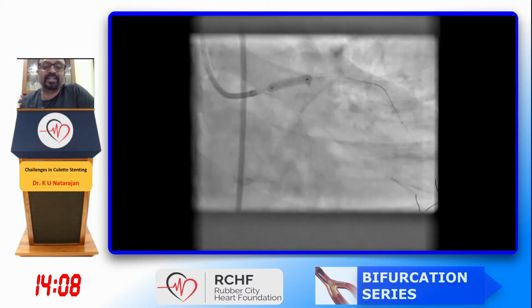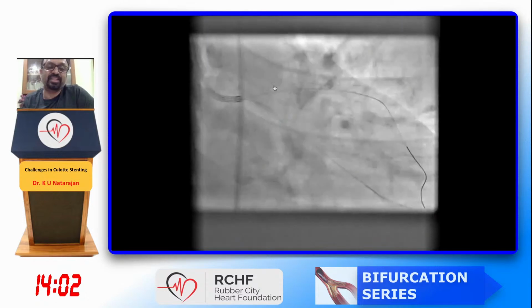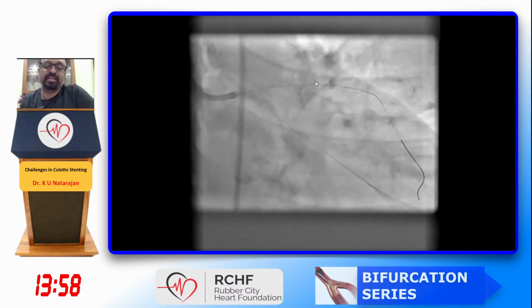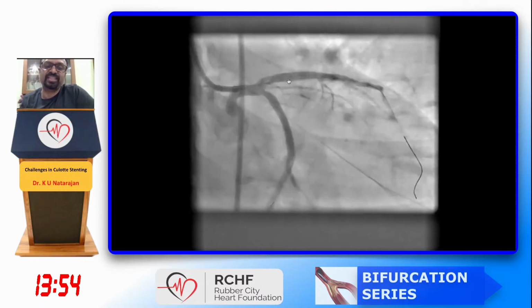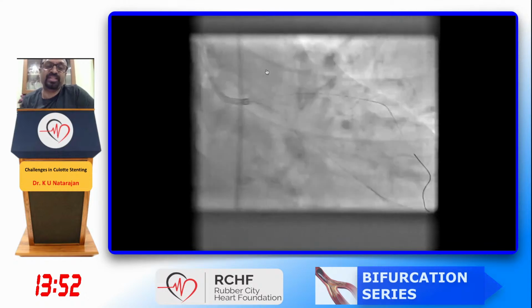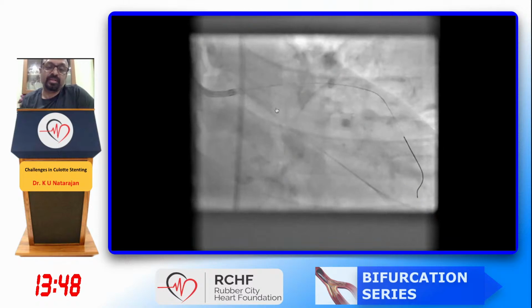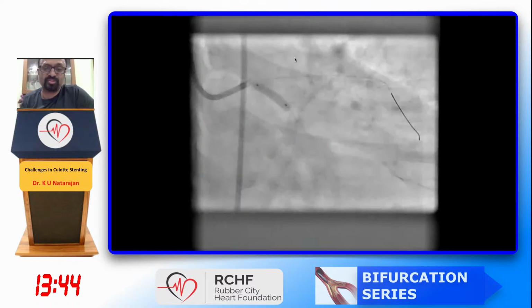So both the LAD and the circumflex were wired. The LAD was dilated with a 3 millimeter balloon, and you can see that there is an ugly dissection at the ostium of the LAD here. This patient became a little symptomatic, the way Dr. Tom was telling in his third case. Though the flow was good, the patient had significant angina. We initially wanted to stent from the left main to the circumflex. Because he was having angina, we had to change the strategy during the course of this case.